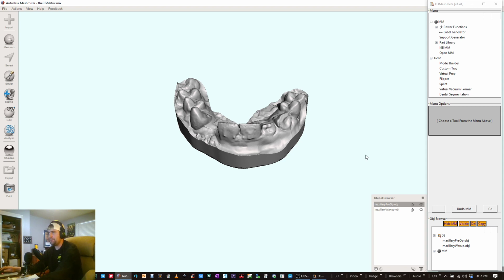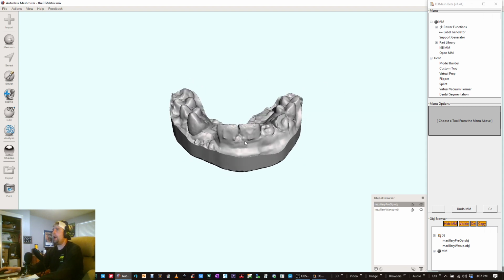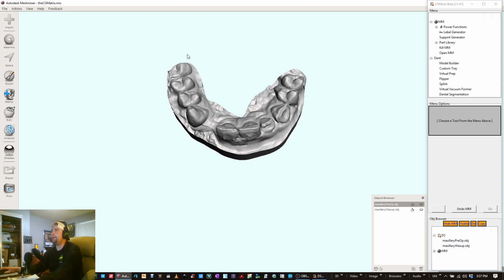So the first question is, what is a CG matrix? What are you even talking about? Literally no clue what you're talking about.